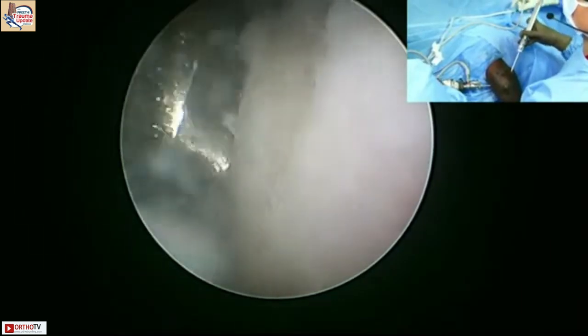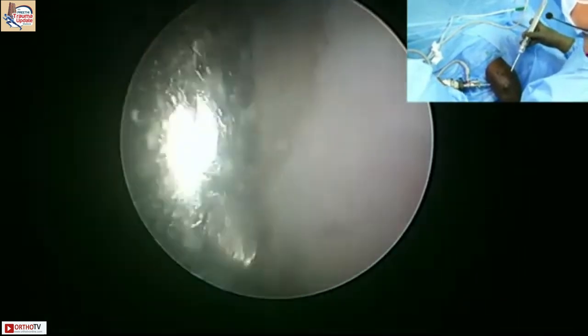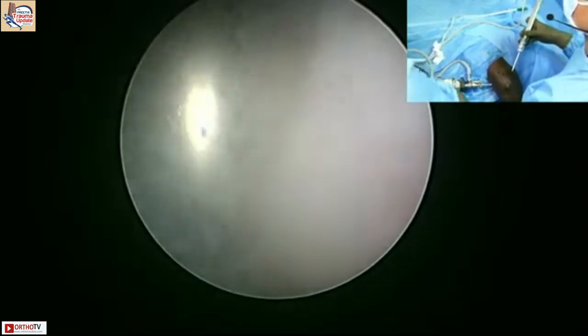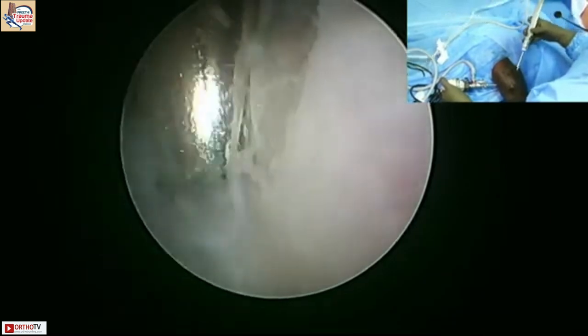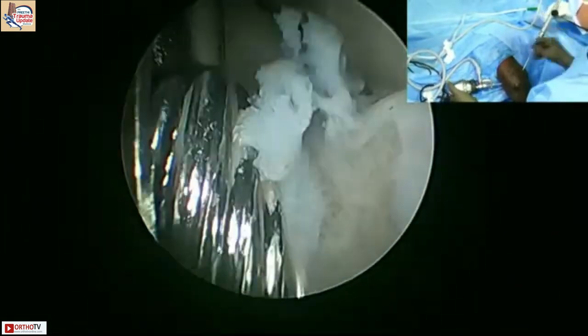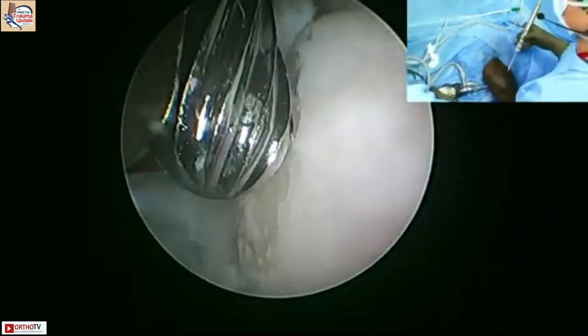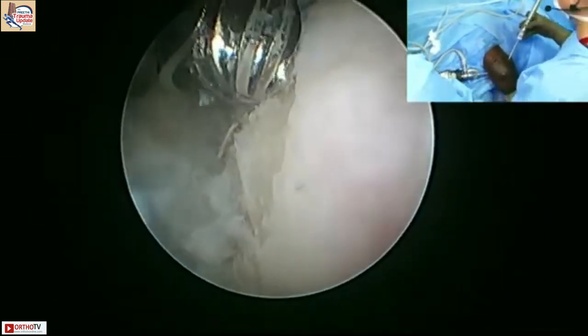So I have to determine how far I can go. So I'm starting lower first. I don't want to go beyond this. My elbow is in 90 degrees of flexion. Is it the same acromionizer burr used for the shoulder? Yeah. So you get smaller burrs, you get a 2.9 burr. Do you prefer the smaller burr? I do. But then with Smith & Nephew, the problem is you need to have a smaller handpiece.